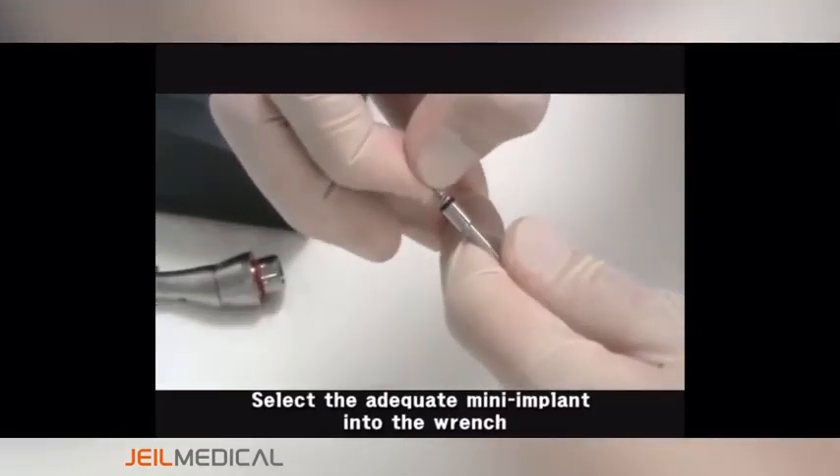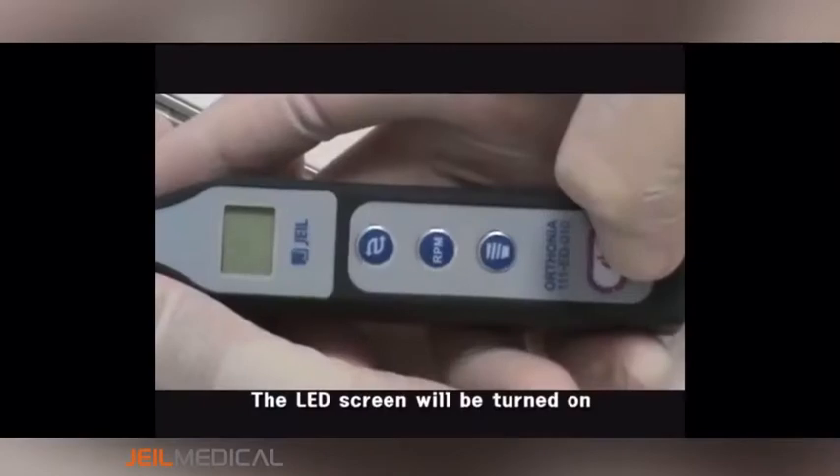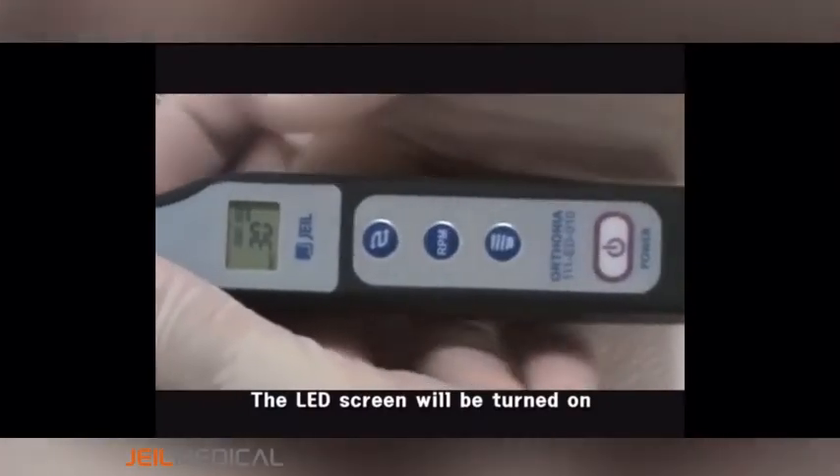Select the adequate mini implant into the wrench. Push the main power switch on the bottom of the main body for two seconds. The LED screen will be turned on.